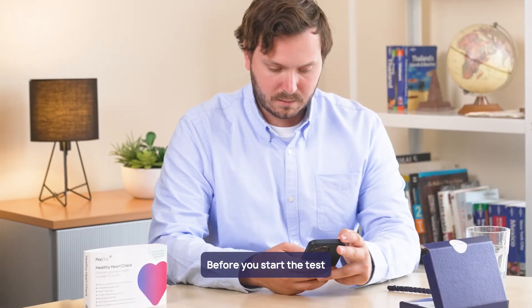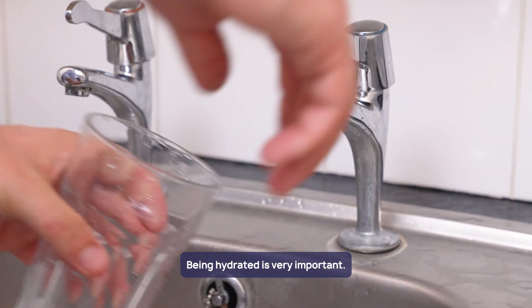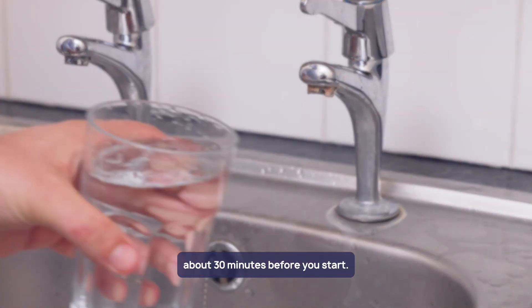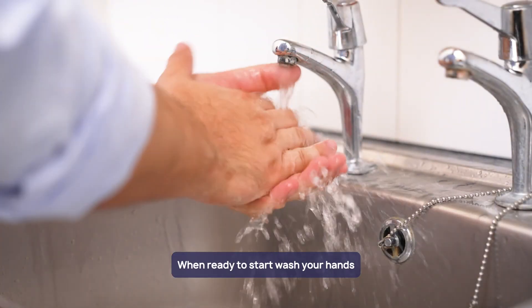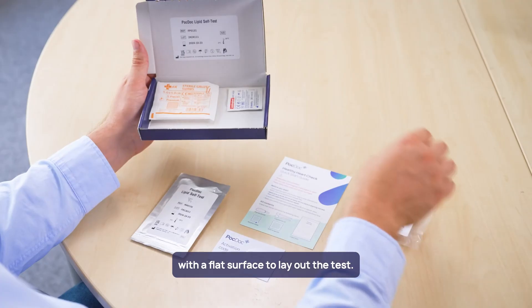Before you start the test, there are a few steps to get ready. Being hydrated is very important, so you should drink a large glass of water about 30 minutes before you start. When ready to start, wash your hands and find a well-lit area with a flat surface to lay out the test.